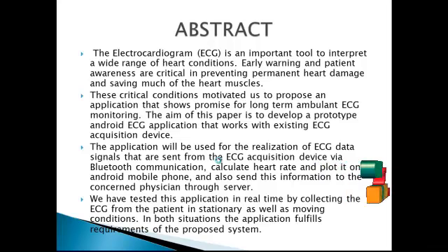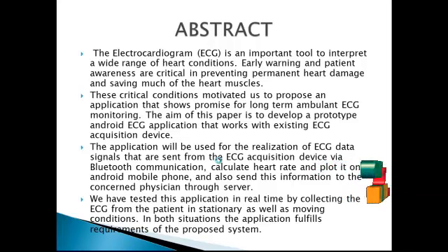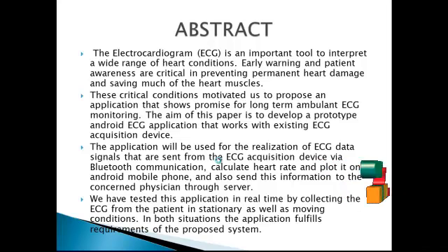The Bluetooth module is a short-range communication system intended for cable replacement between electronic devices. It is low-cost and low-power. A Bluetooth system consists of an RF transceiver, baseband, and protocols or supporting services.